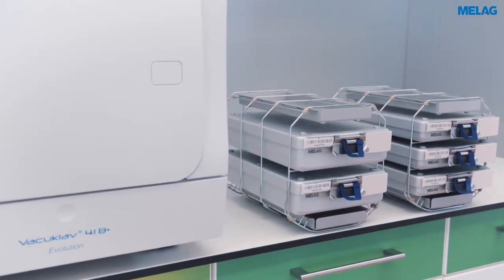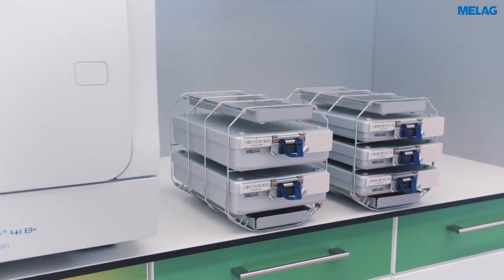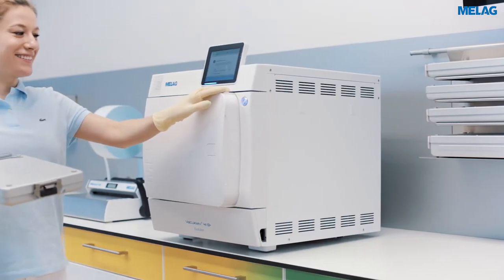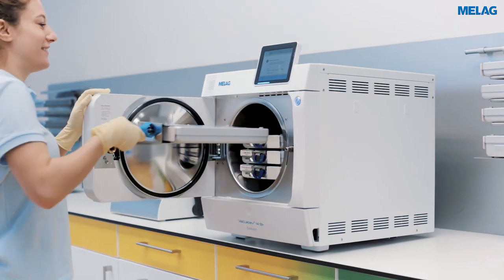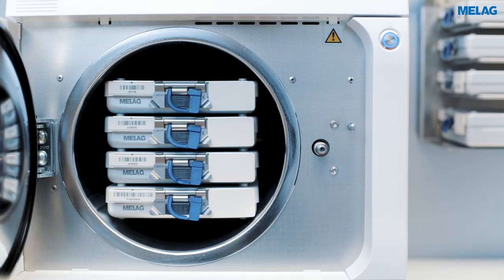Our wide range of mounts enables you to adapt the loading of the steam sterilizer to your individual needs. The D plus and F plus mount make for an efficient loading with sterilization containers and additional instruments on the trays. A maximum load quantity of nine kilograms even permits the sterilization of up to four Melag store boxes 100.